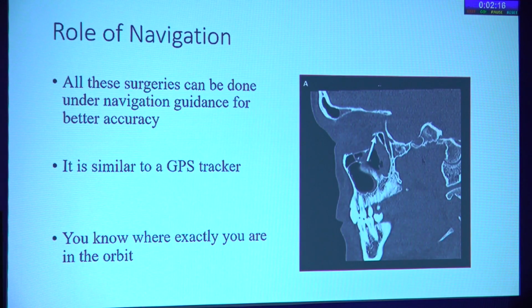And so what is navigation? Now, all these things are done manually. We design, we cut the implant, and then we put it in manually. But still, we do not know whether we are in the right place. Navigation will tell us where exactly we are inside the orbit.